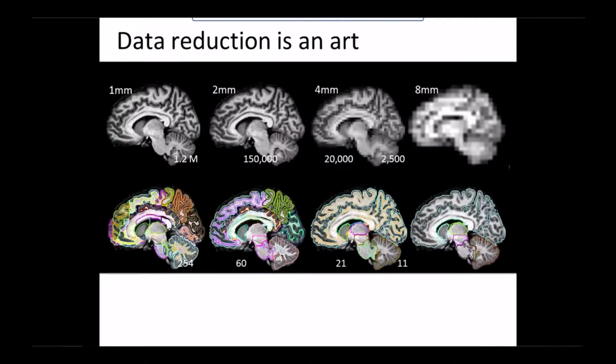So we'd like to reduce the dimension, just like when you get a blood test, so that we can get a series of informative numbers. We can't work with 3 million numbers or 1 million numbers, so we have to get a series of numbers like you have in a blood test that are essentially telling you the essential information in that scan, and then that gets put into the large searchable database along with your age, along with your clinical phenotype. Patient is reported to have sepsis and they have a high fever 3 times in the last month, that kind of information, along with our index. And the question mark represents how to go down in dimension to that information.